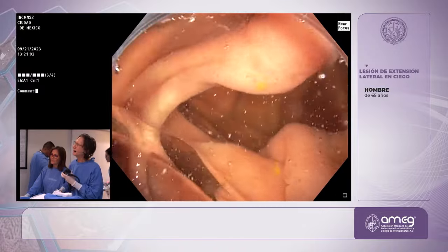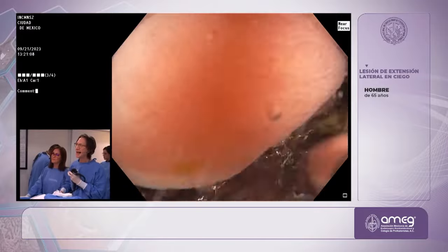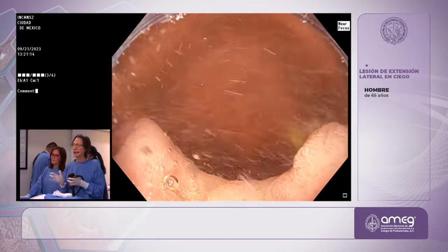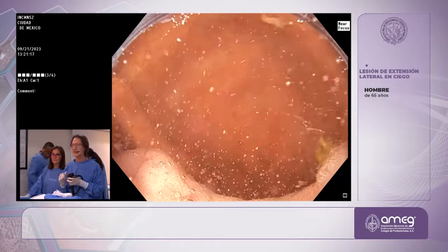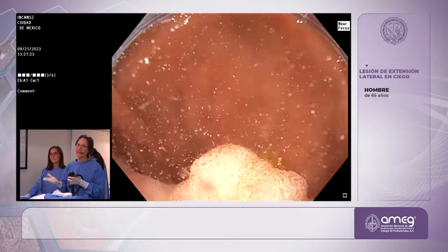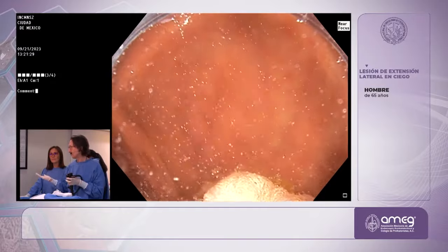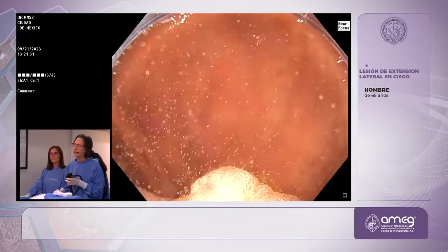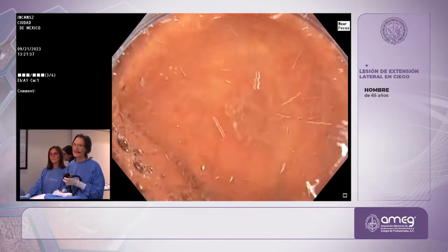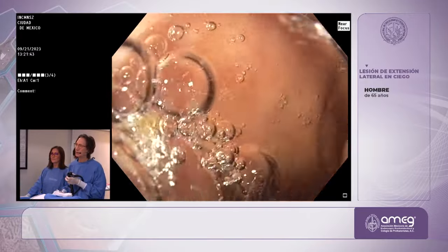All right, now, this is a very big lesion. And unfortunately, they do not have the snare that I usually use. I always try to do an en bloc resection with the largest snare necessary to do en bloc, to get it out in one piece. And that is why underwater rivals ESD, because usually I can get it en bloc. Unfortunately, the largest snare that is available to me is a 25. I usually use the Captivator 2 from Boston, which is 33, but they don't have it here, and I didn't bring one with me. So unfortunately, I don't think that I'll be able to do this en bloc.